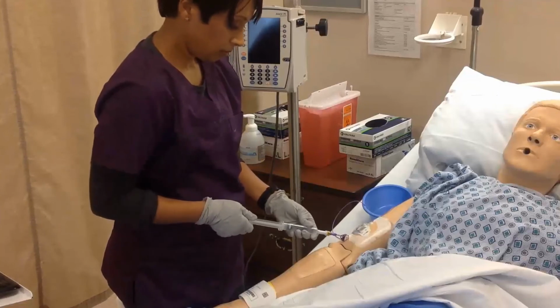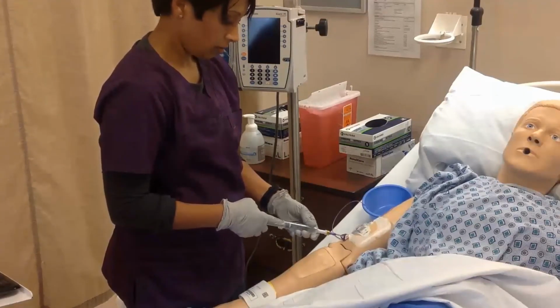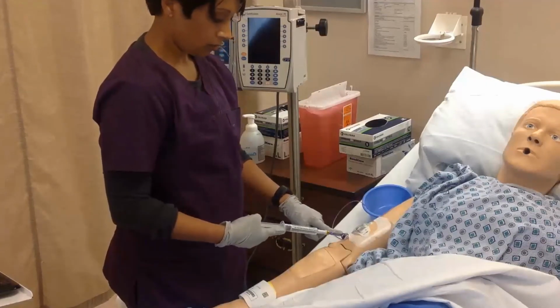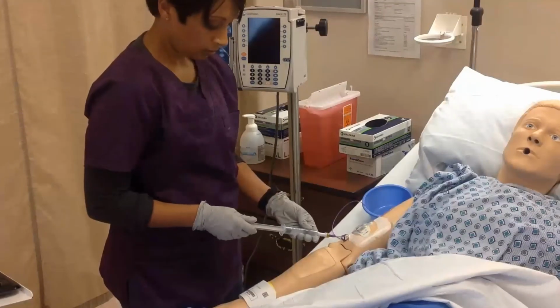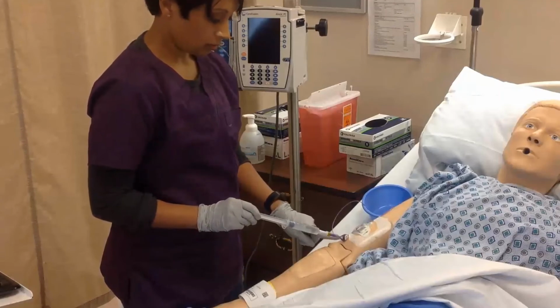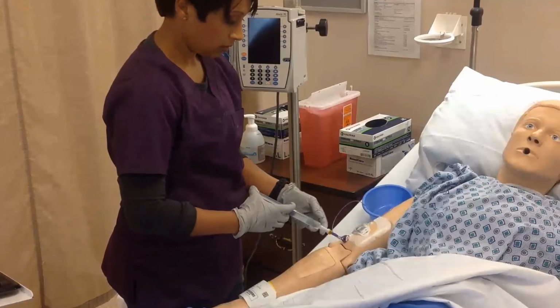Access the PICC port with a normal saline flush by pushing and turning into the luer lock. Gently pull back on the syringe knob until blood is seen in the PICC lumen, remembering that only the barrel and knob can be touched. This is called a flash and indicates the vascular access is in the correct place. It is safe to flush the PICC line.